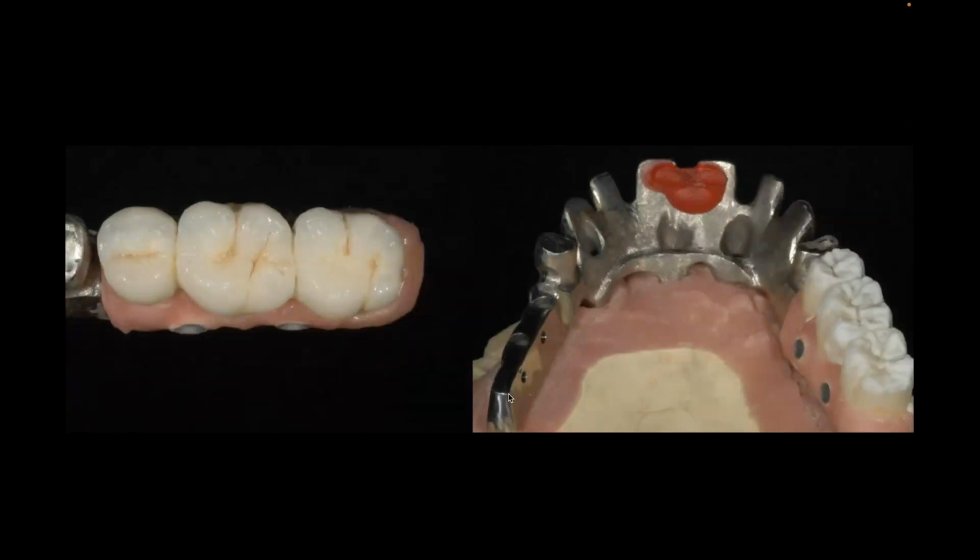And what is that? My dots. A dot, a dot, a dot. And if I can't capture that dot, then I'm never going to be able to make this work aesthetically from an anterior position. I want to get that bilaterally balanced occlusion.